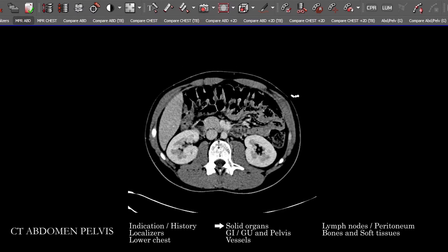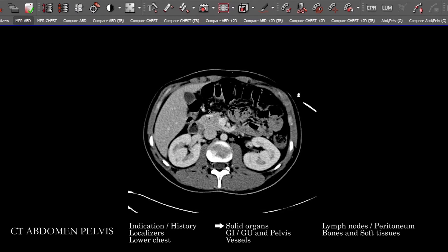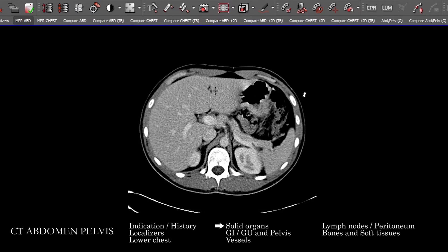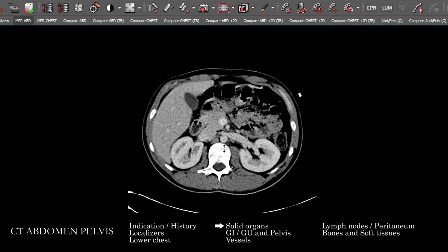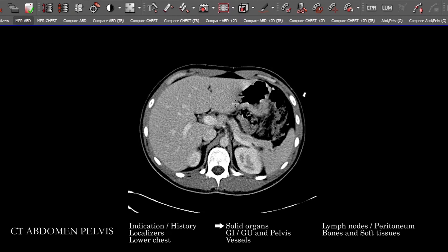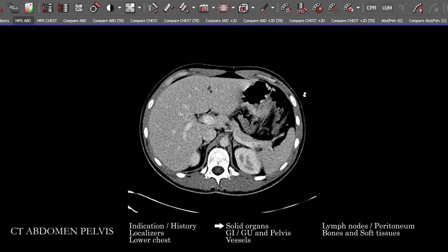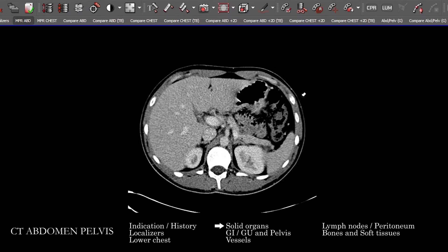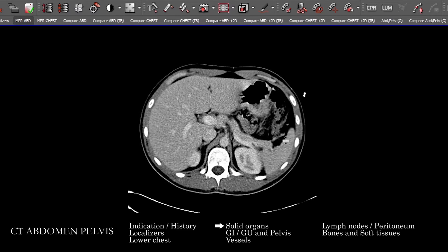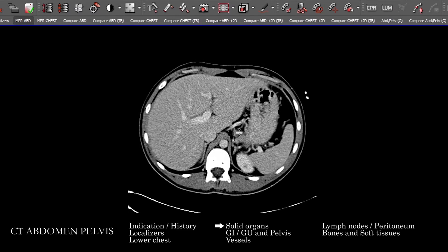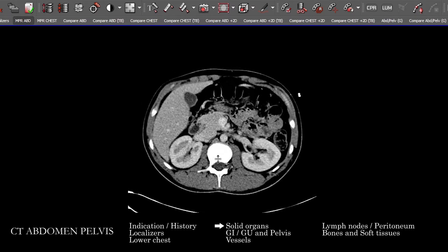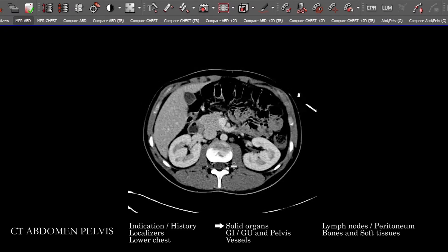As we see, the pancreas is wrapping around here, and we're looking for focal mass lesions, hypodensity, cystic structures, intrapancreatic and peripancreatic fluid collections, and inflammatory changes. We're going to follow that around to the tail, looking carefully and also noting the duct there — if that happens to be dilated.